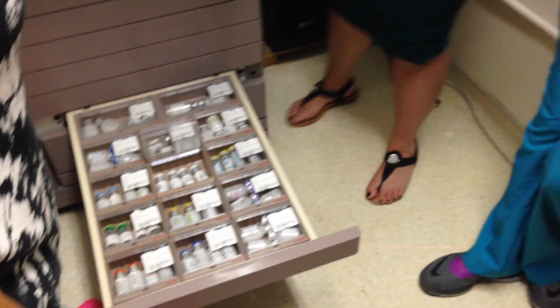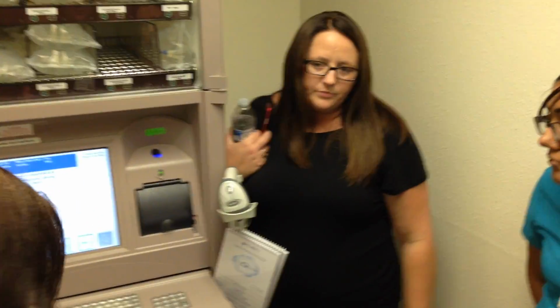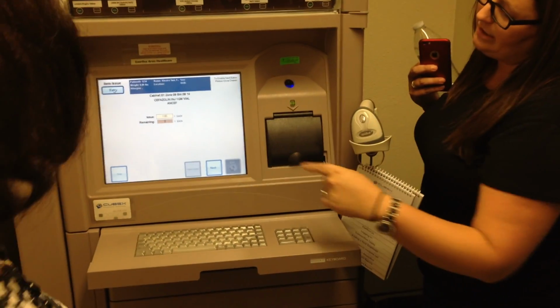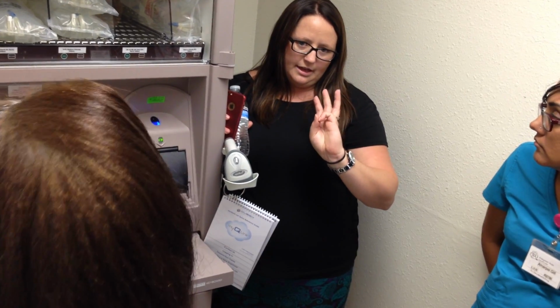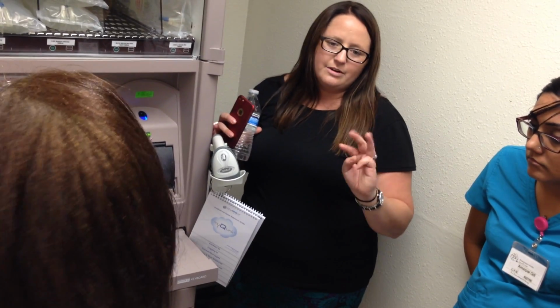Now for some reason, if it doesn't open, or you forget to grab your medication, the retry button, we'll pop it back open for you, okay? That retry button in the left corner is very handy. Use it if you need it. The screen's going to tell you I'm taking out one and there's 3 left. If that's accurate, great. If it's inaccurate, let one of the administrators know, which is Myra, Virginia, and Marianne. That's your DNS rate, DON. Let one of them know, and they can correct the count, and I'll show them how to do that.